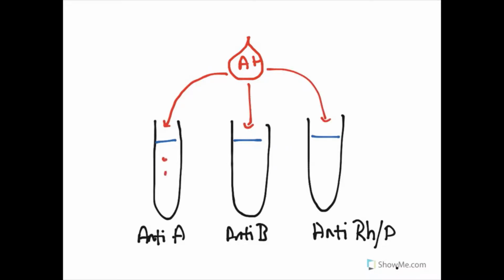We saw visible clumping here because any of the antigens that were on that blood would have been clumped together. It did nothing here, it visibly just mixed together nicely, and clumped considerably here as well. Now, with that, we could identify this patient as type A. So if you were to put blood into tubes and we got this result, then we would say they are A positive blood based on the results here.